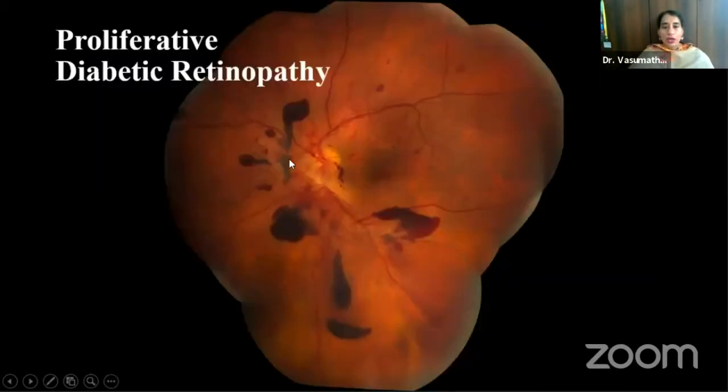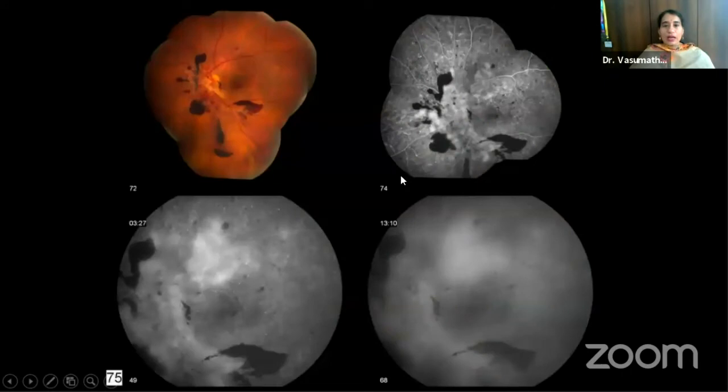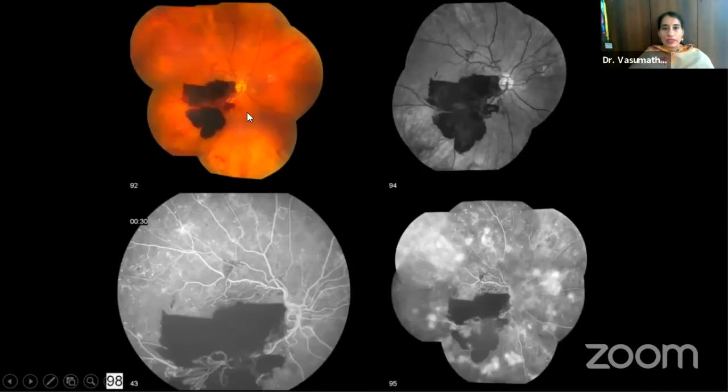And this is a proliferative diabetic retinopathy, and you can see that the macula doesn't seem to be involved that much, and clinically it seems quite obvious. So in this case, fluorescein angiogram is almost unrevealing because it doesn't give us any new information, because of the excessive leakage from the new vessels on the disc and elsewhere. So in such cases, for the general ophthalmologist and for us also, it's better to avoid asking for an angiogram, where things are so clinically obvious.